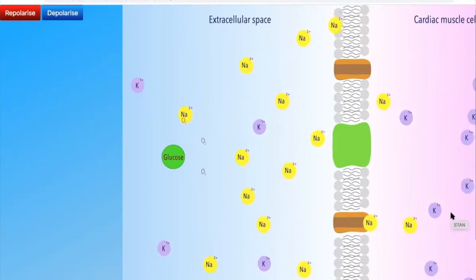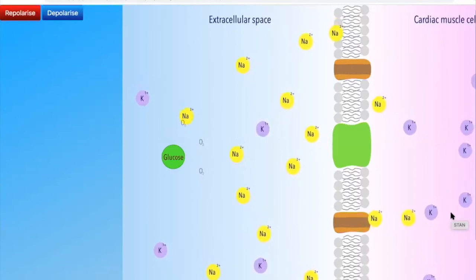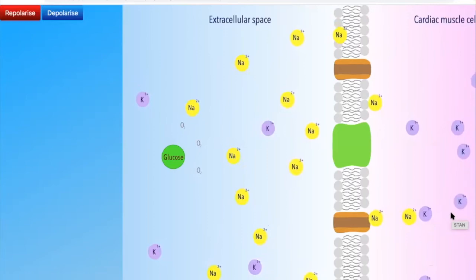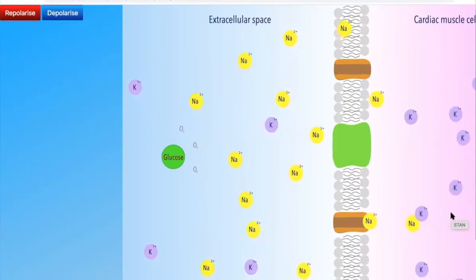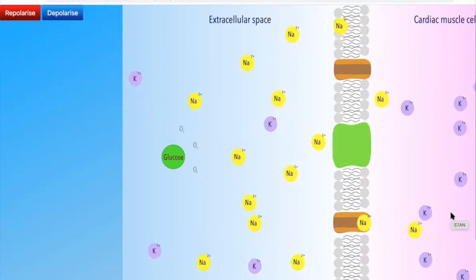Now, if anybody remembers any laws of physics or electricity, charge or electricity flows when ions are moving. When ions are sitting in a steady state, there is no movement of electricity.